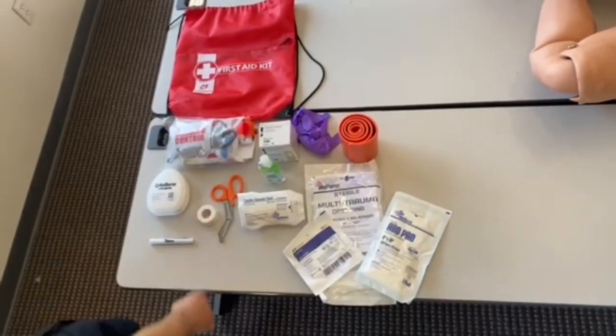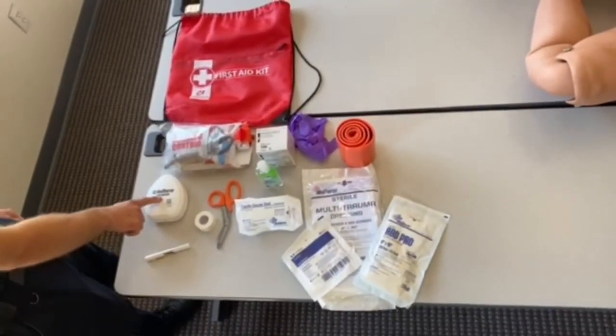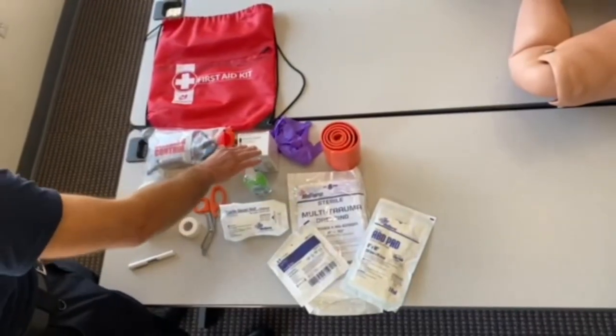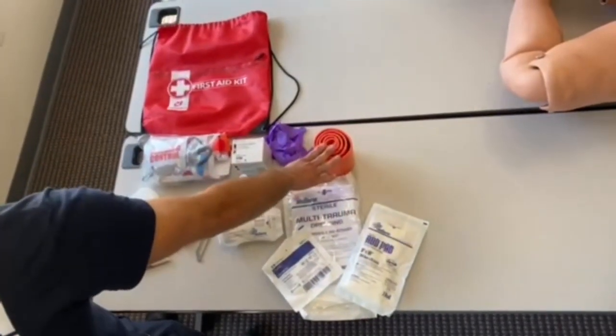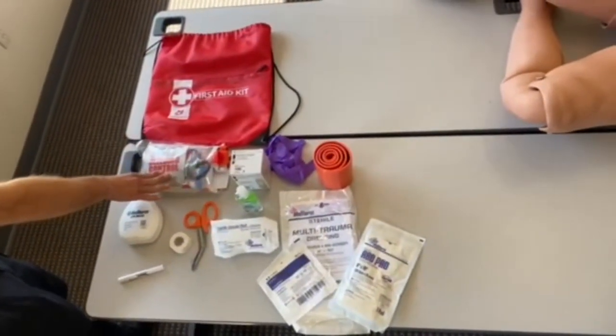You also have scissors, tape, a light, a CPR mask for doing mouth-to-mouth, hand sanitizer, band-aids, a set of gloves, and a splint. And the most important item: the bleeding control kit. We'll show you how to use all of that.